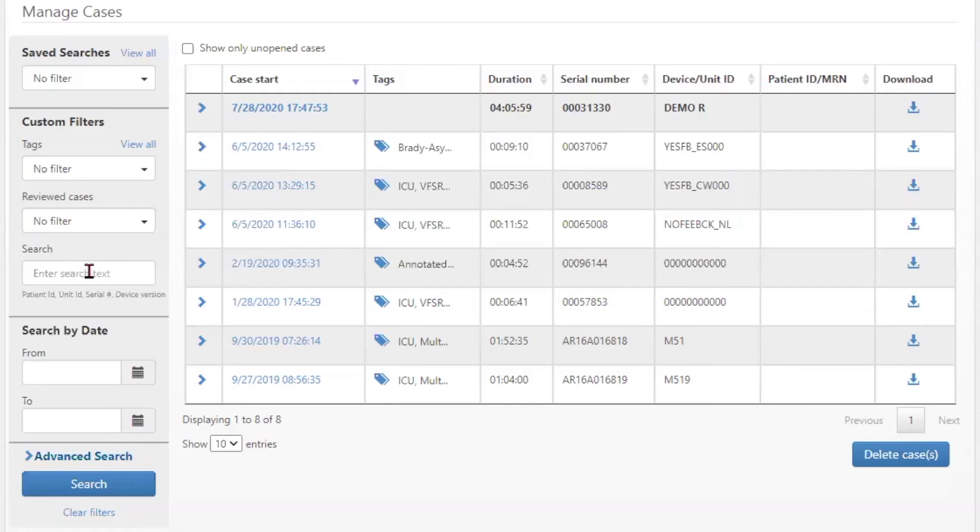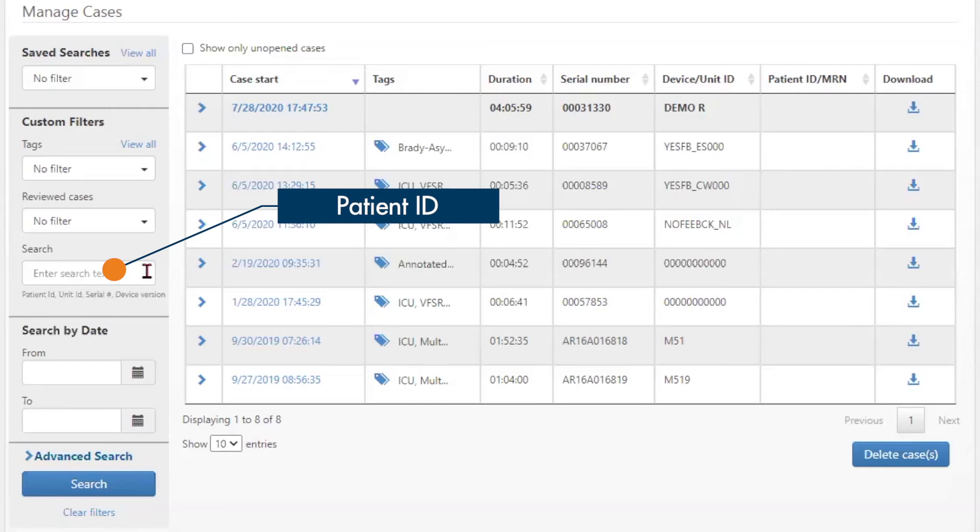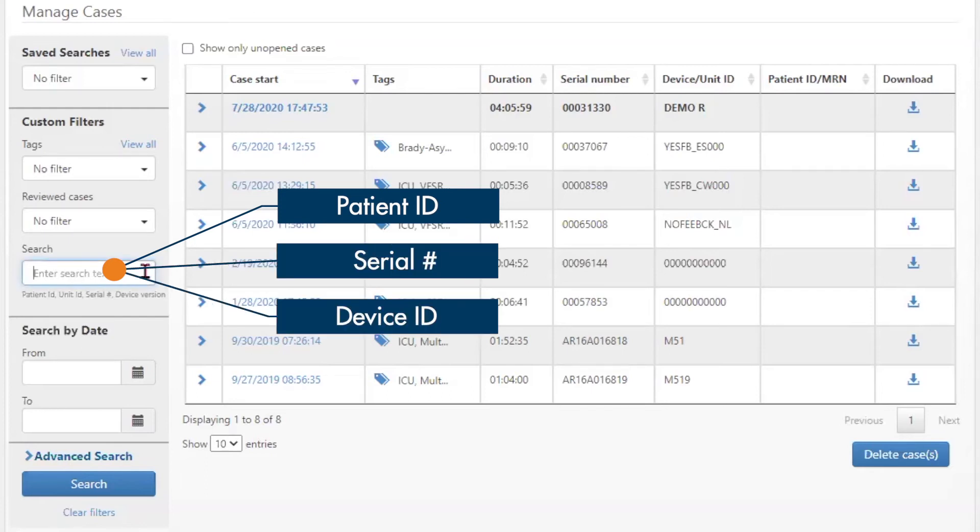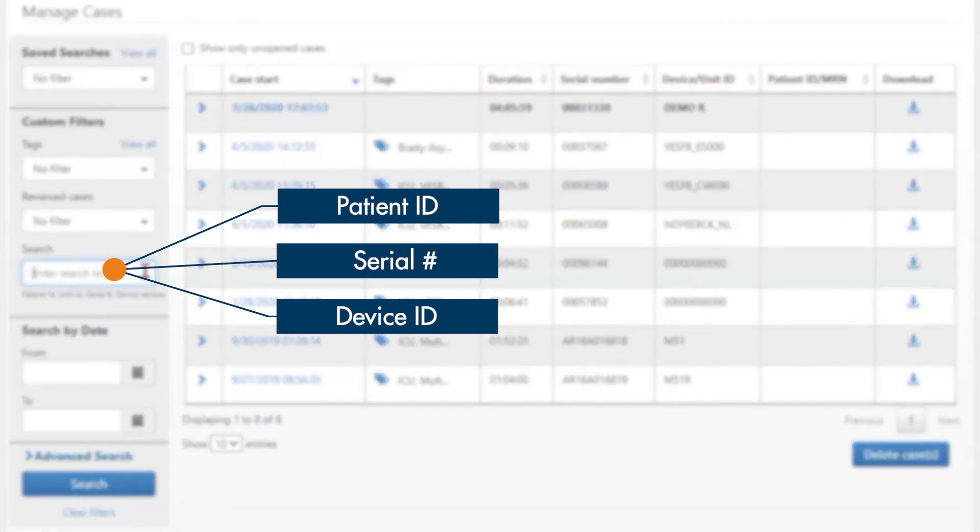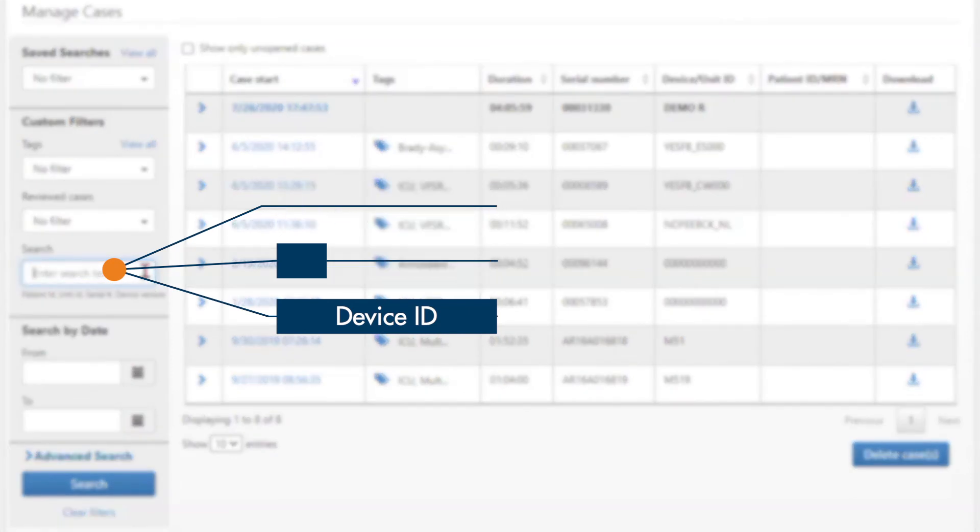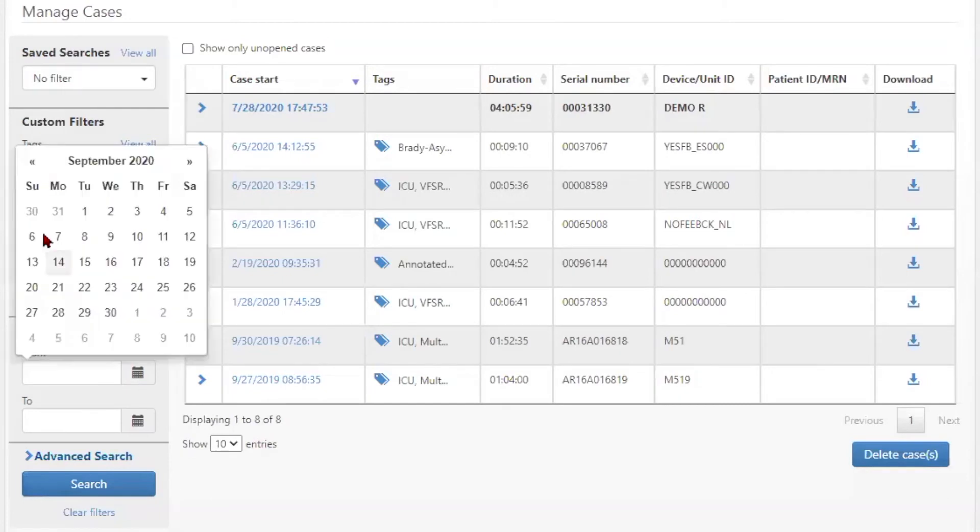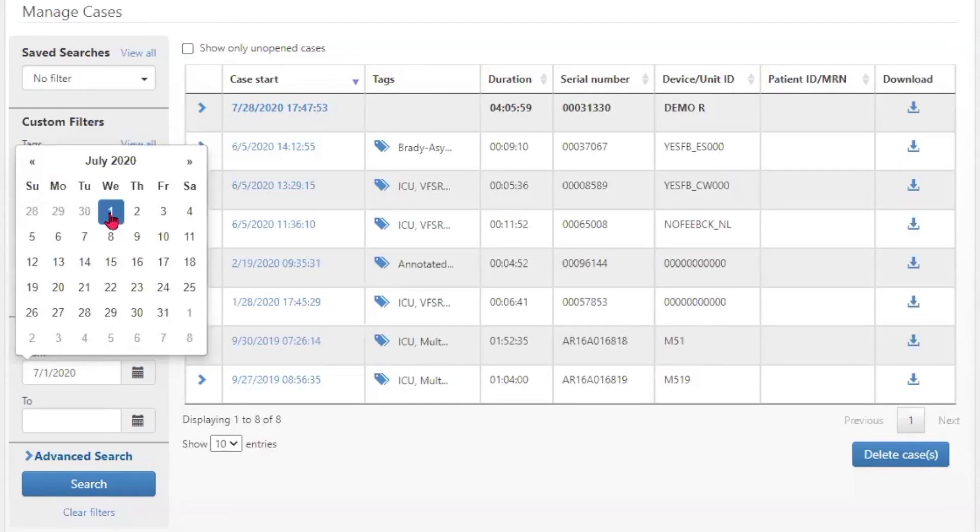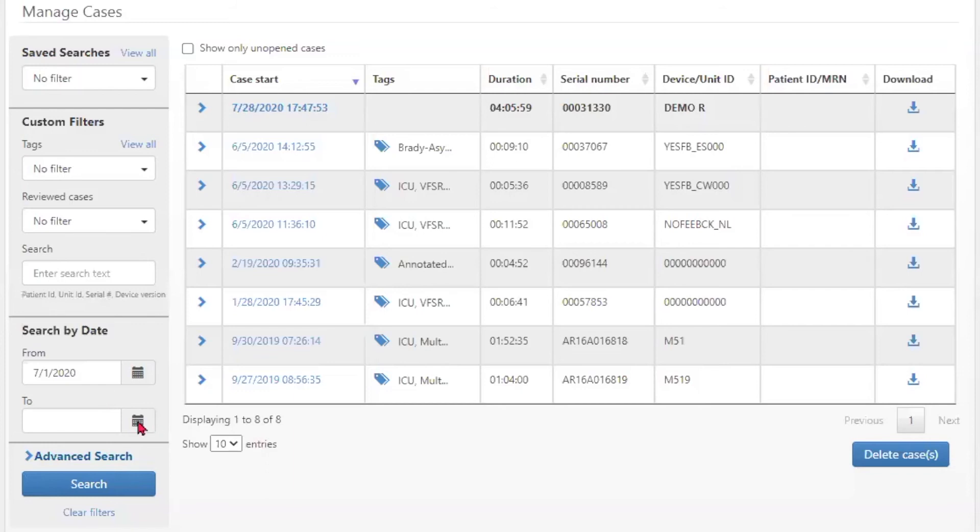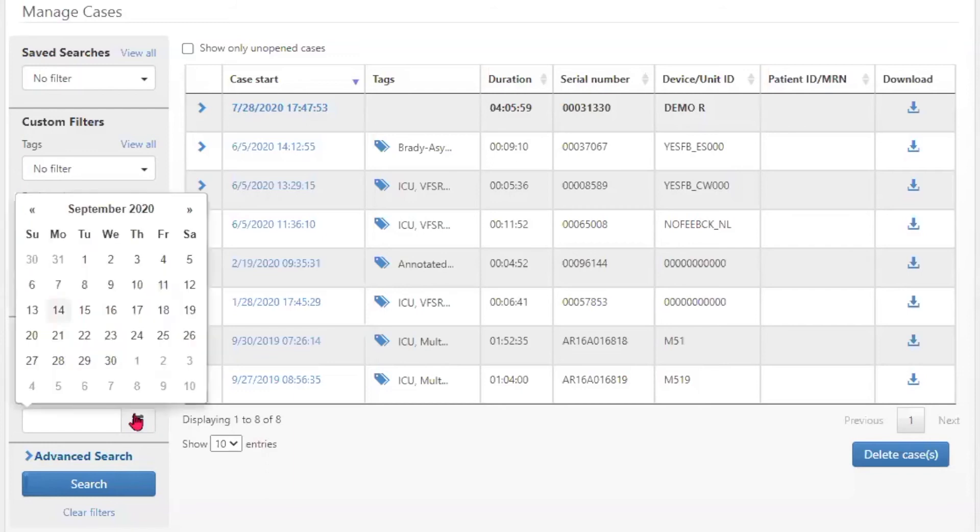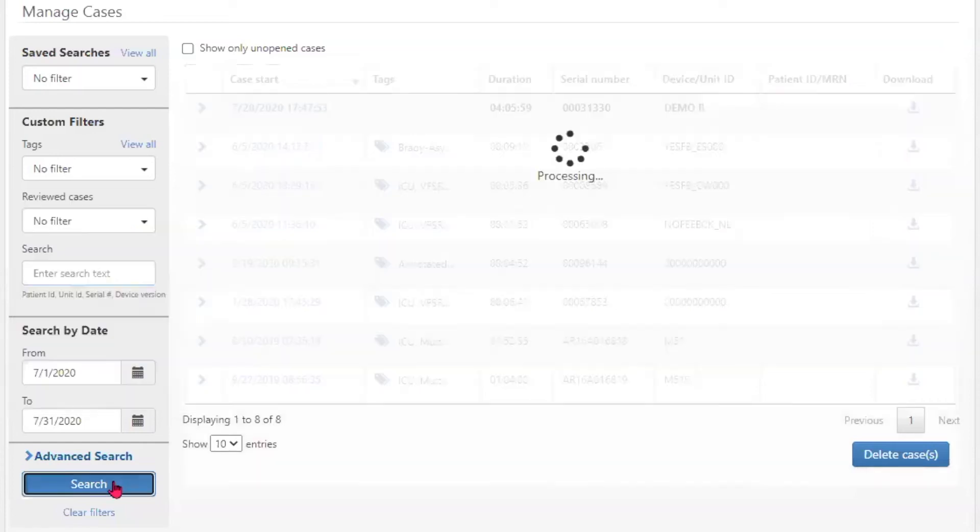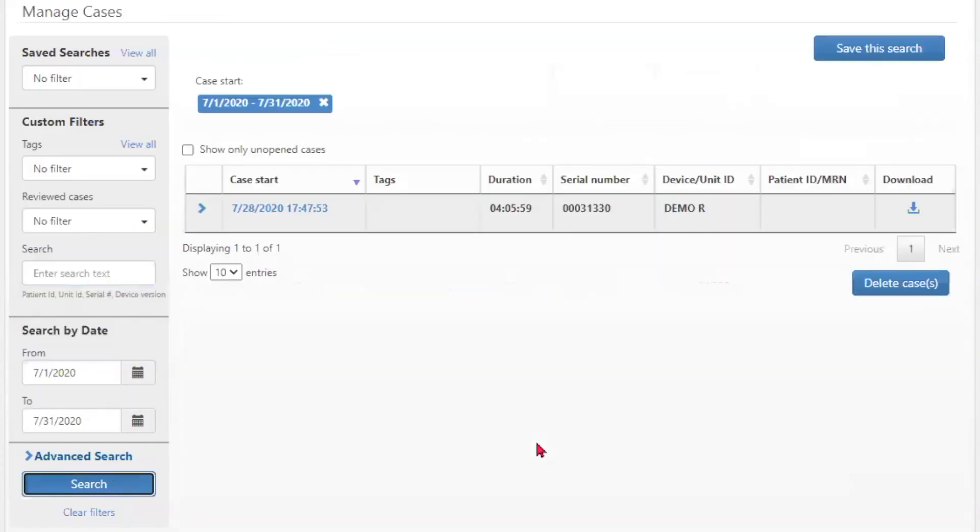The search section allows the user to input specific text criteria such as patient ID, serial number, or device ID and search for cases that meet that criteria. Search by date allows the user to select a particular time period and search for cases within that time. By selecting a beginning date and an ending date, the user can display those cases.